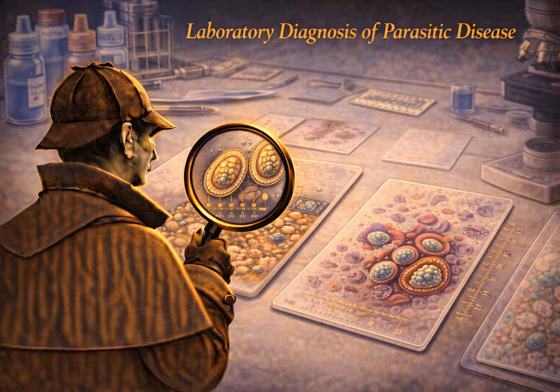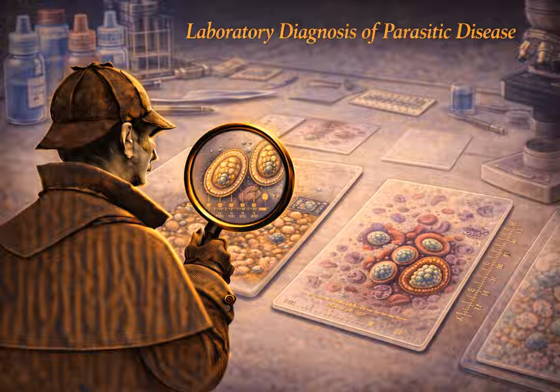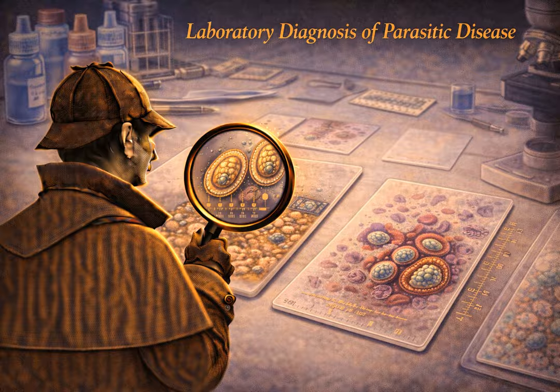So if interventional radiology is aspirating this, they have to specifically sample the capsule wall or send the very last part of the aspirate fluid to the lab to find the organisms. If they just send a tube of the central pus, the lab will report it as negative sterile fluid. That is such a critical clinical pearl. Anchovy paste is dead. Look at the edge.